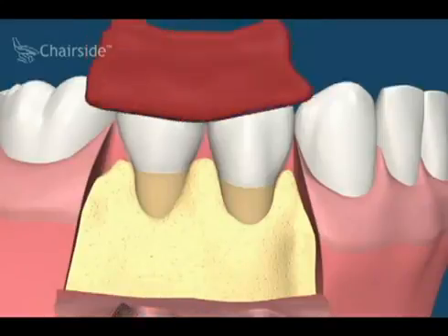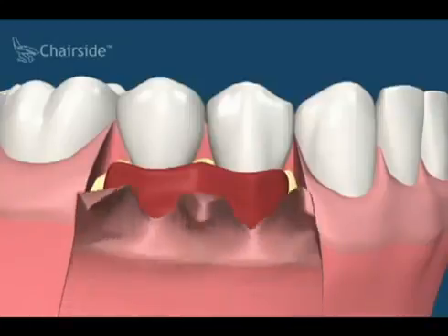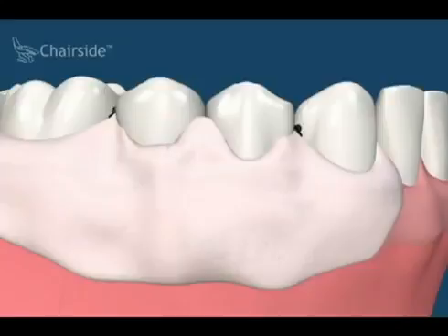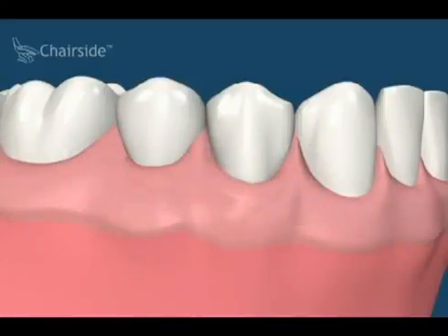A connective tissue graft is placed over the root areas. The gums are then moved higher up on the tooth and sutured into place, covering the root areas. A protective packing may then be placed. The attached gingival tissues heal and cover the area and roots.